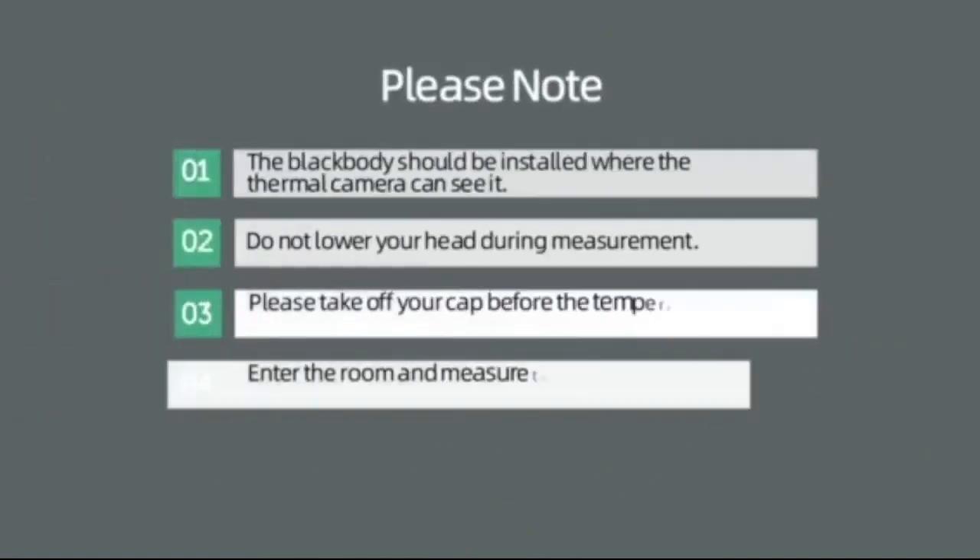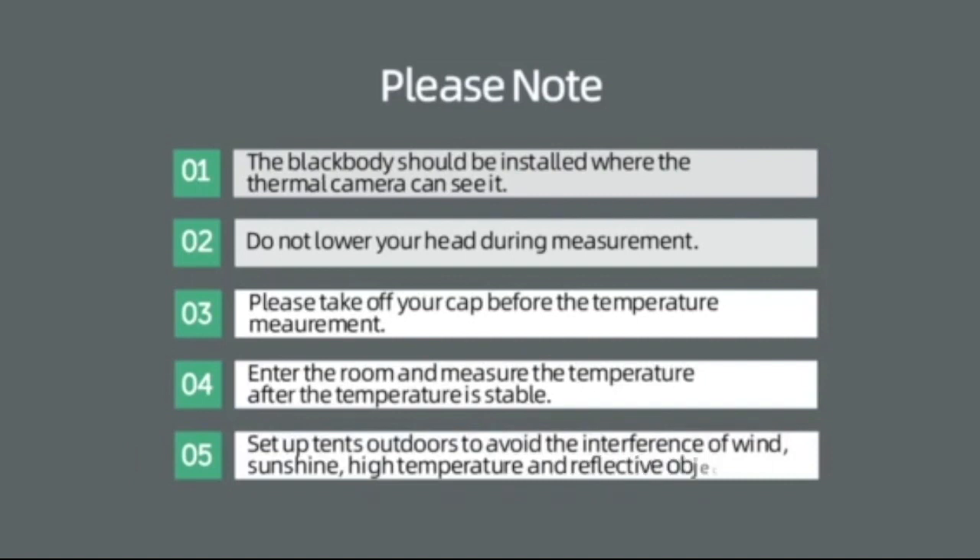1. The black body should be installed where the thermal camera can see it. 2. Do not lower your head during measurement.